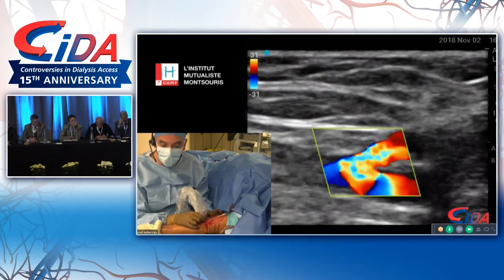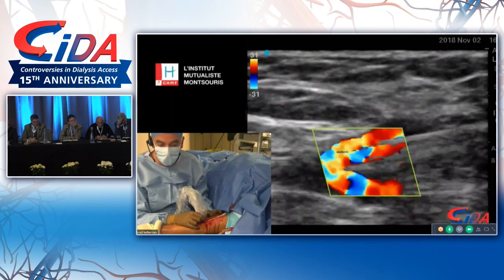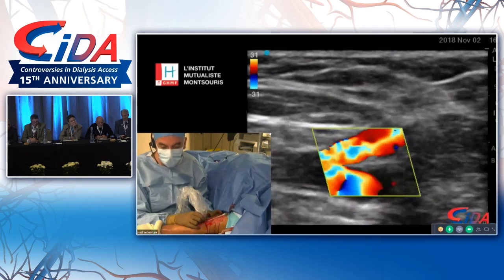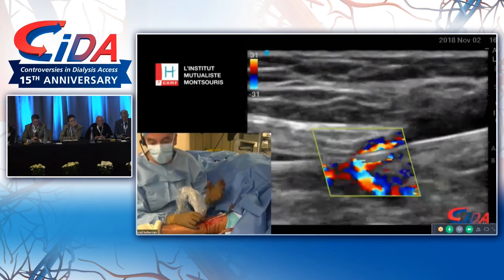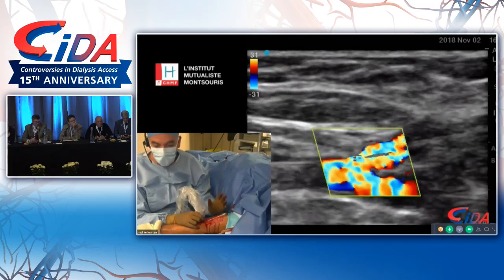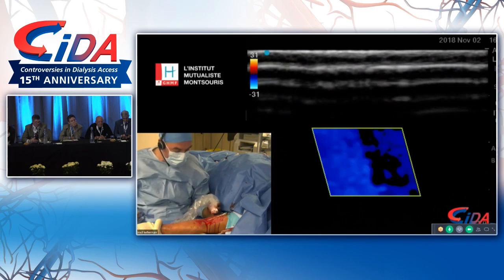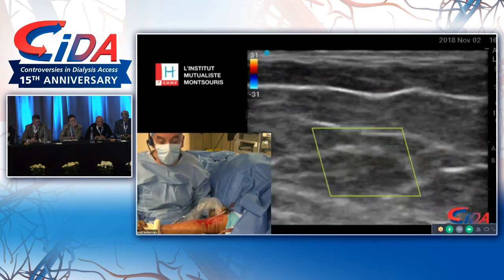So we didn't have any issues with the most calcified artery you can imagine. I remember I did a patient with previous finger amputation, horribly calcified arteries, and we were able to finally do it. So I'm not saying see a patient with a calcified artery and party about it, but I don't think it's a horrible problem to have when you are going to do this.